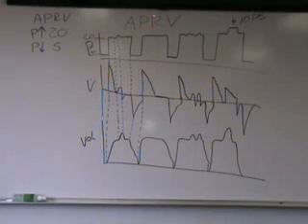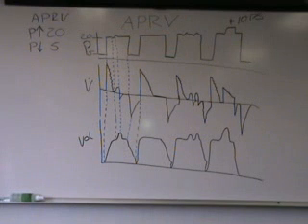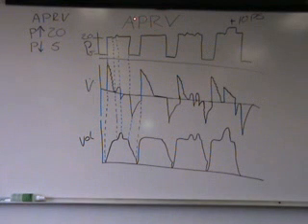Okay, so here we have airway pressure release ventilation, also known as bi-level ventilation. I believe another name for it is bi-vent. It's a pretty interesting mode of ventilation that utilizes two levels of pressure to ventilate the patient.